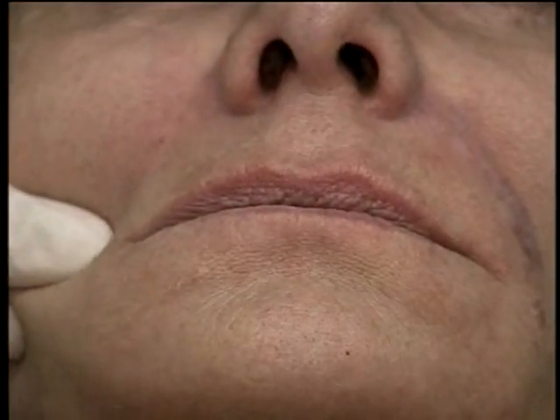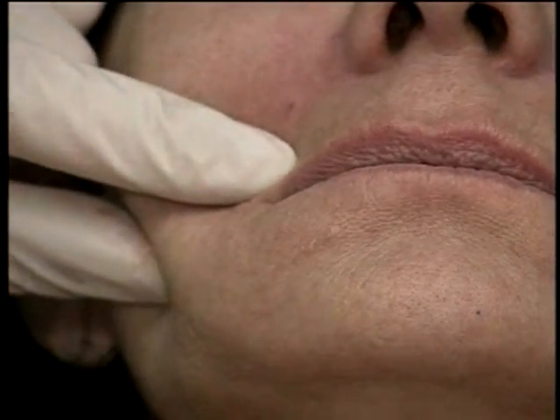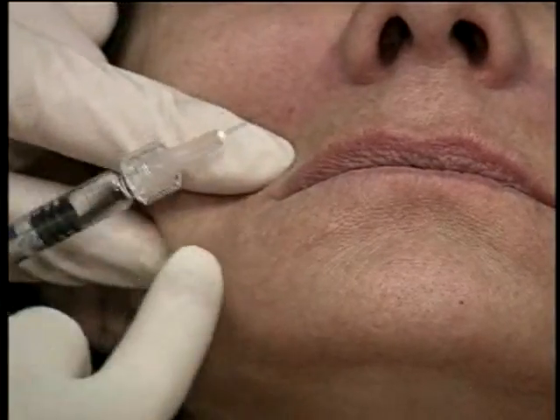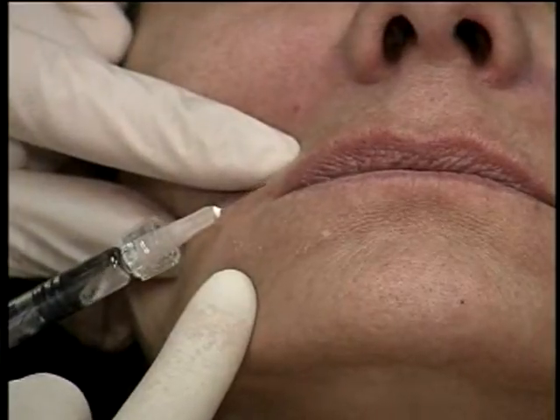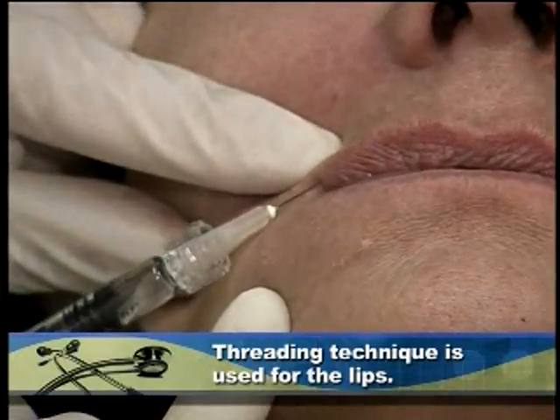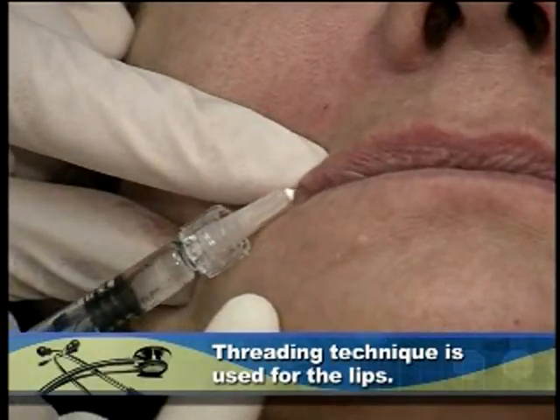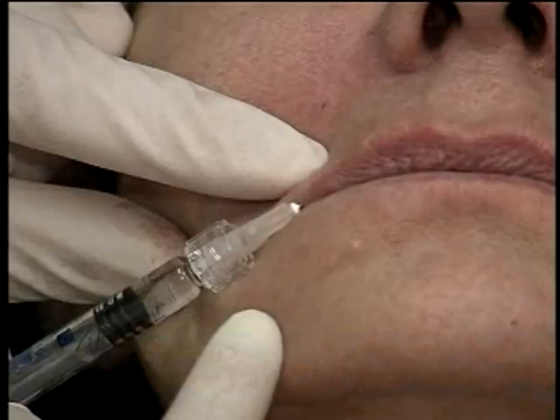So pull the cheek back here a little bit like this, and the lip is on tension, which makes it easier for me to treat. I'm going to do a threading technique where I go to the hub of the needle and then deposit as I withdraw. So I start at the end of the oral commissure. I'm right underneath the red-white lip borderline, and I'm just underneath the mucosa, in the submucosa.